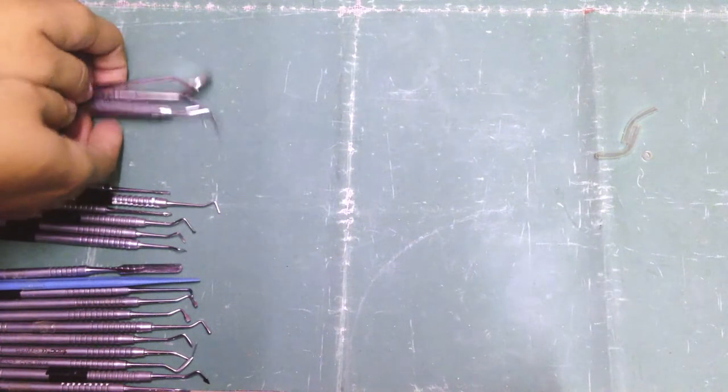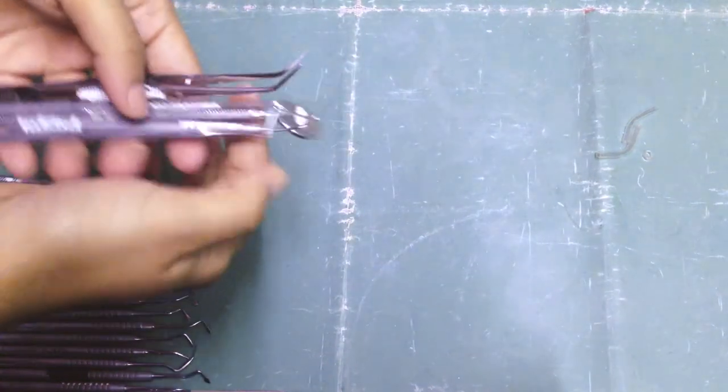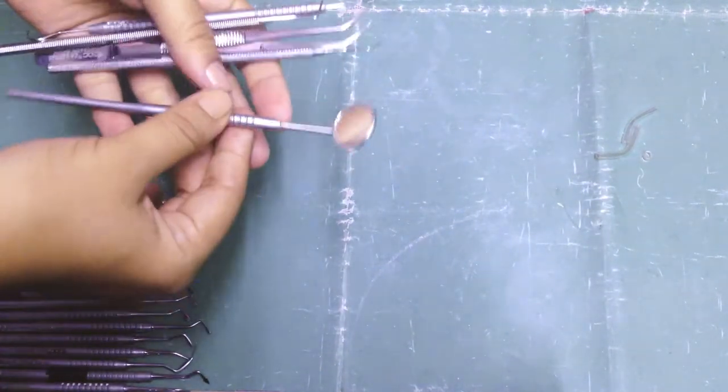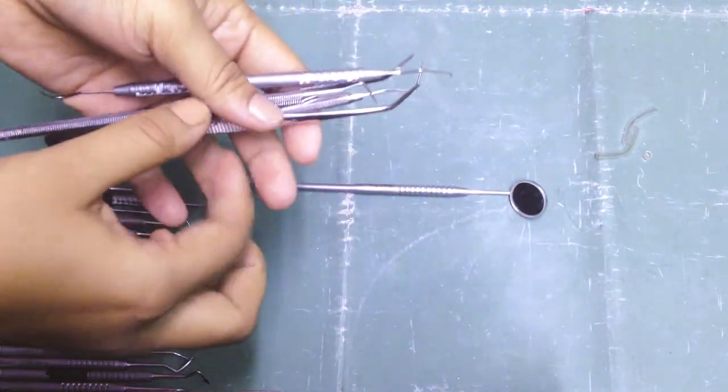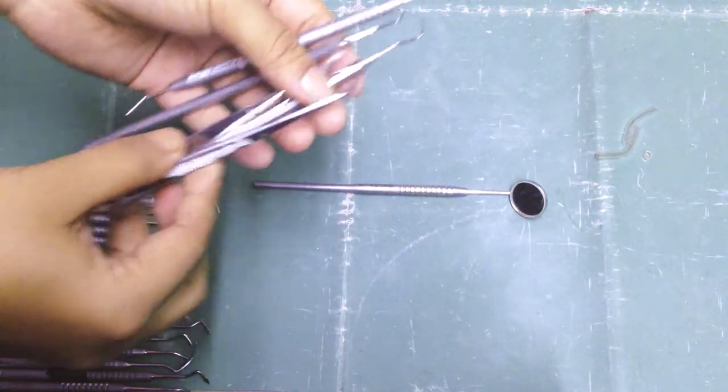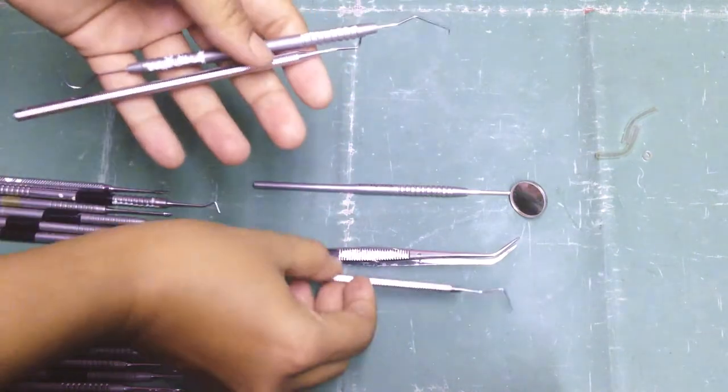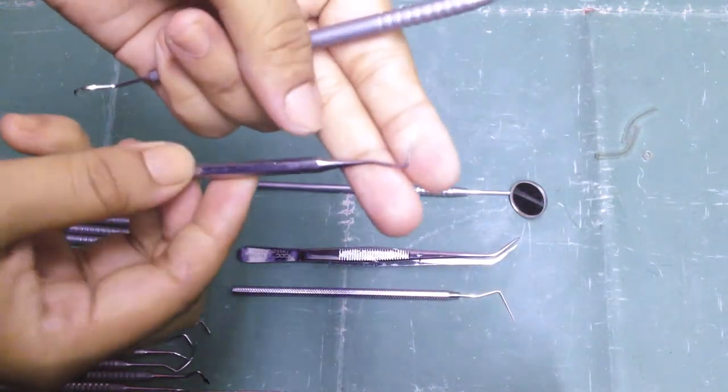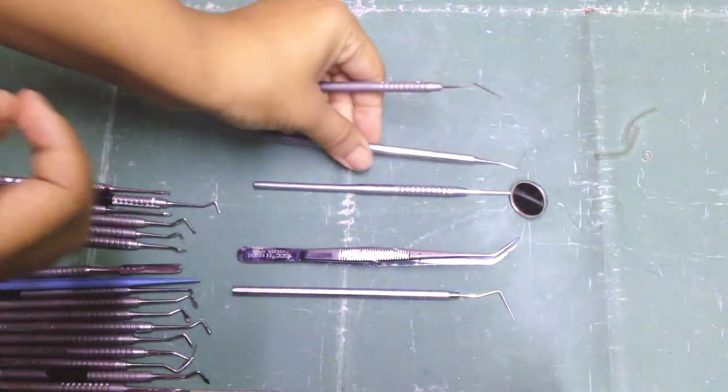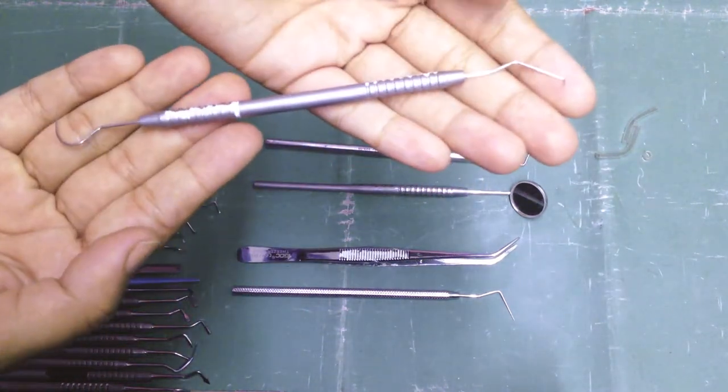Let's start with our diagnostic instruments. Here I have diagnostic instruments, and this is a mouth mirror. Then we have some explorers or probes, and this is a straight explorer, a straight probe. Then some explorers.